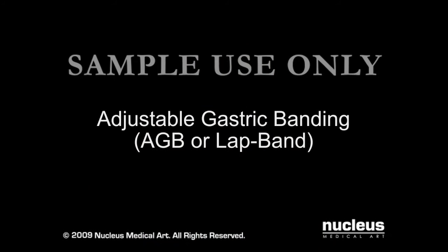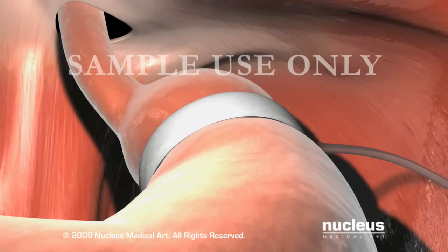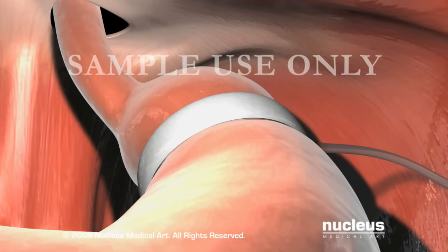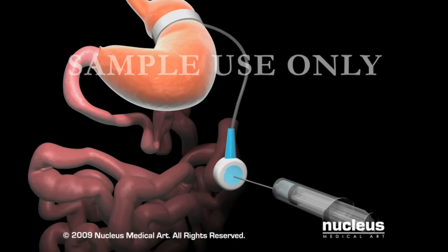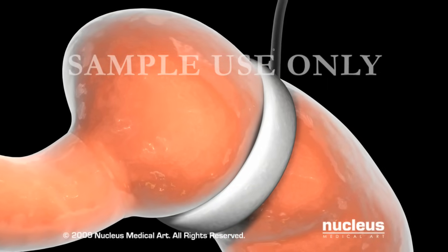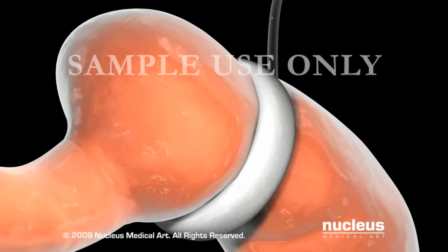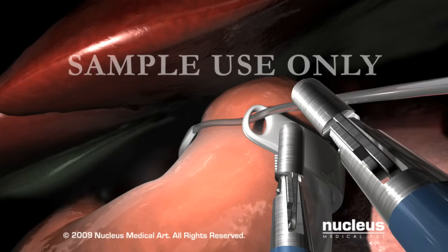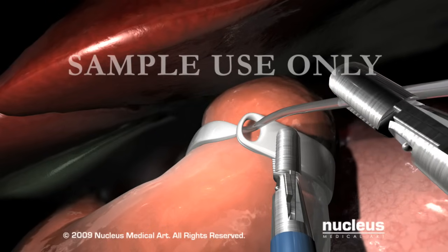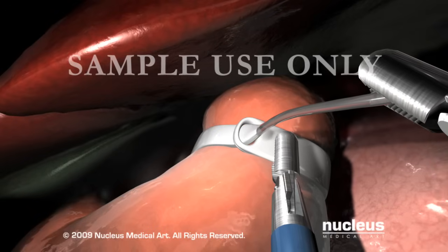During an adjustable gastric banding procedure, also known as AGB or lap band, your surgeon will wrap an inflatable ring around the upper part of the stomach. As the band is inflated, it will squeeze the stomach to create a small upper pouch and a narrow opening into the larger lower portion. This may be done through tiny incisions using a laparoscope. The band may be adjusted at any time.